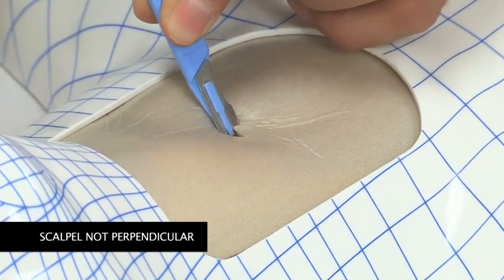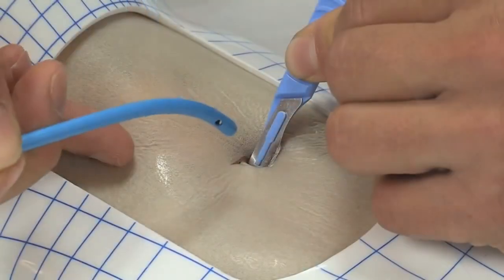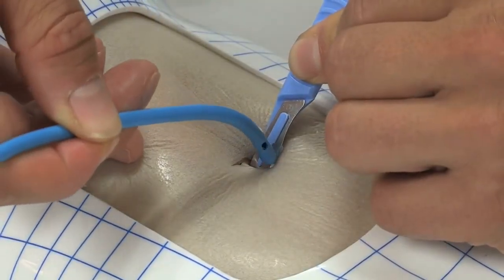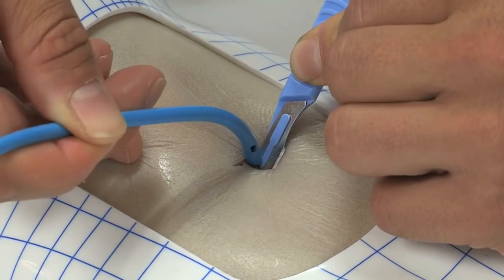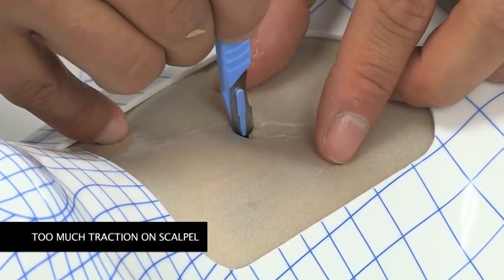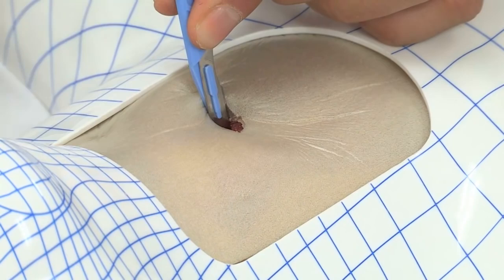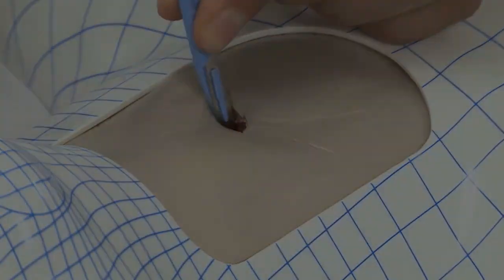After the stab incision, holding the scalpel in a not perpendicular fashion can obstruct the opening and make the insertion of the bougie difficult or impossible. After the stab incision, too much traction on the scalpel will narrow the incision, possibly rotate the trachea, and can make the insertion of the bougie more difficult.